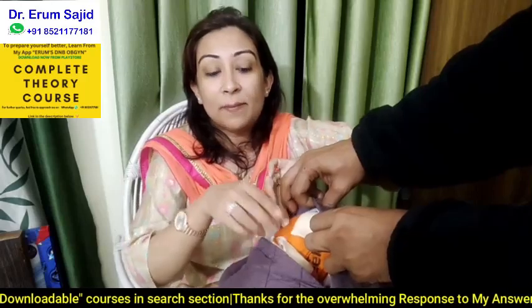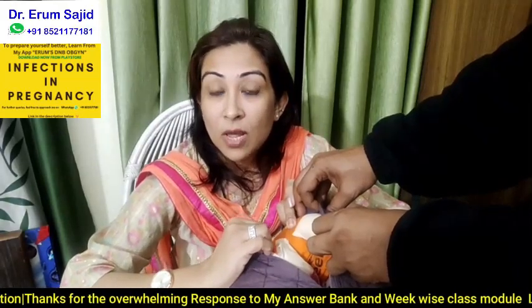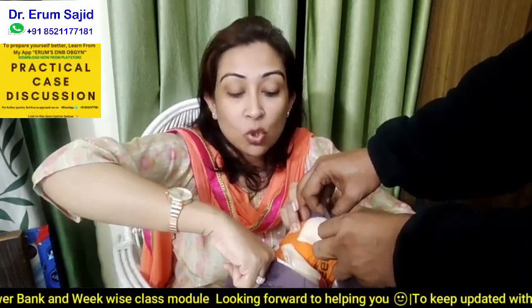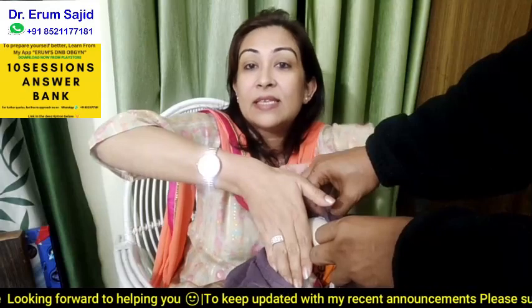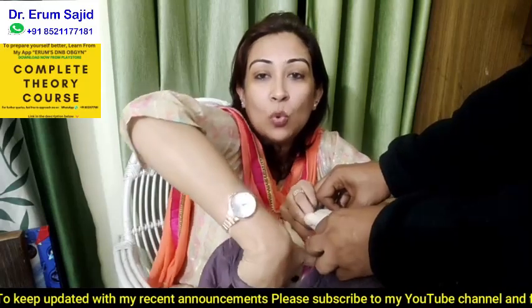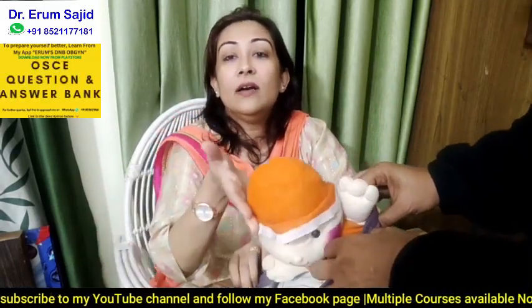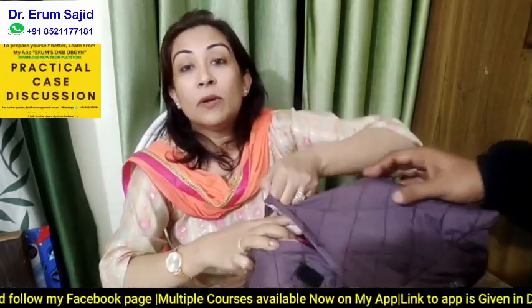With the assistant helping, look at my hand movement — going like so. This flap also has to go down, but usually the Doyen's retractor is nudging over it. So you take your hand below the Doyen's and inside the uterus — first like this, then swooping it out. If it is too high an incision, ask the assistant to push like this and deliver in a scooping fashion. Let me demonstrate again — place it back and show the scooping movement.